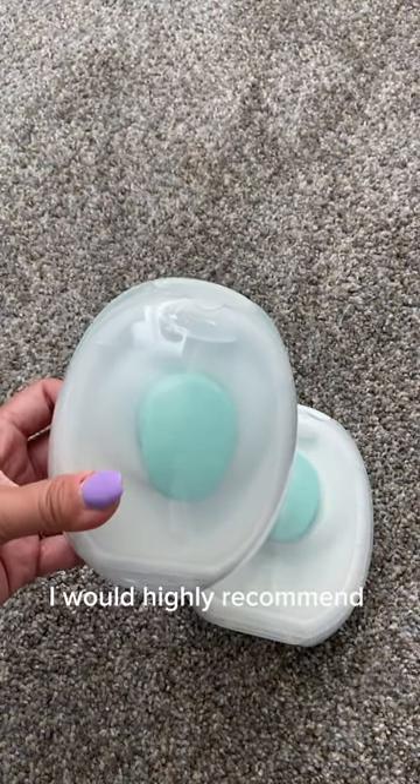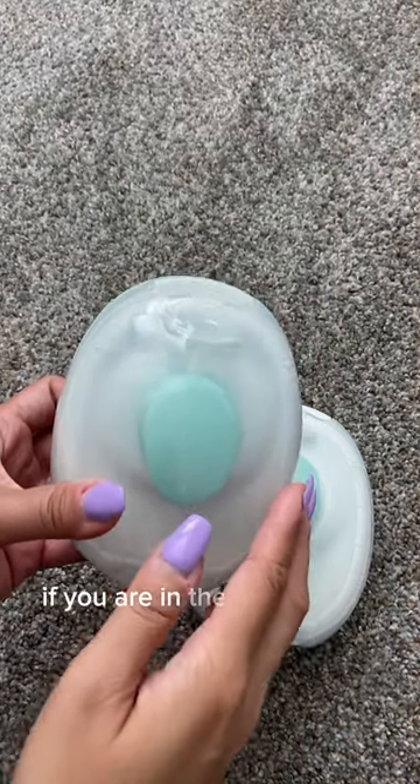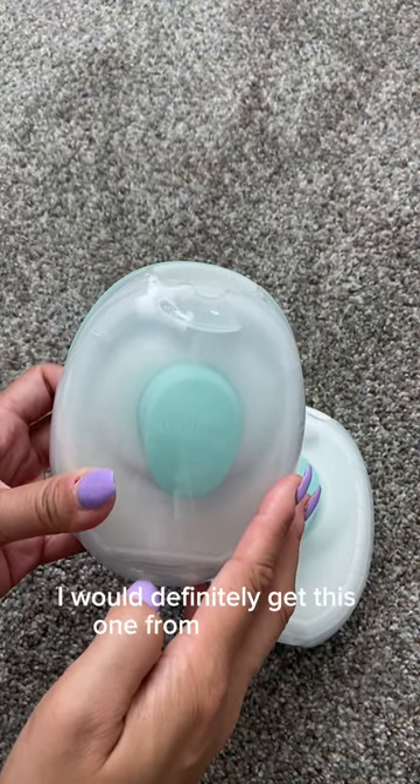Outside of that, I would highly recommend this breast pump. If you are in the market for a wearable one, I would definitely get this one from Willow Go.